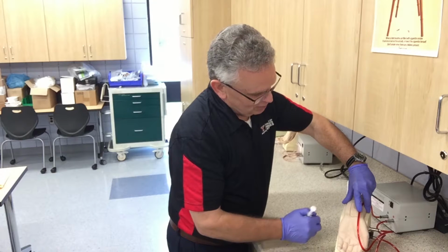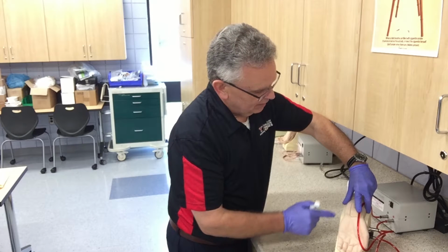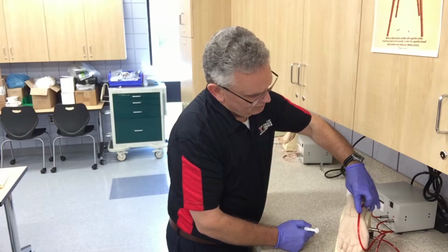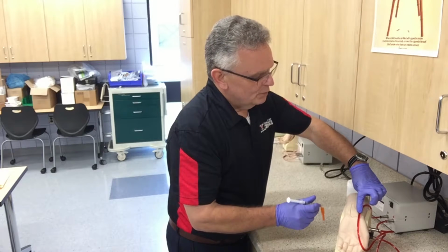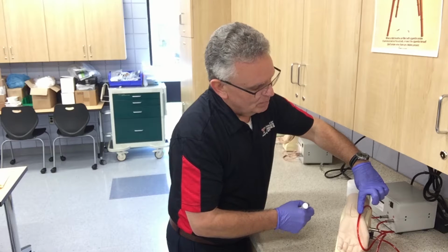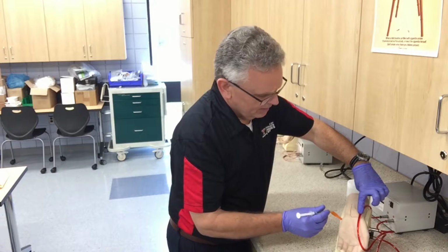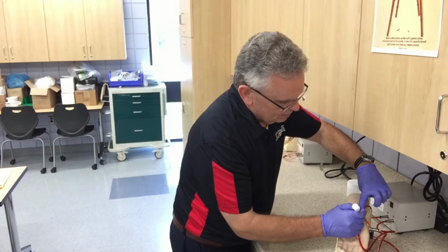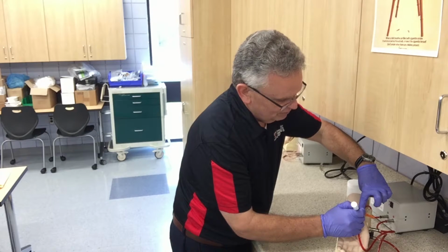So when you're palpating the radial artery, you're going to roll your finger slightly from side to side. Again, the finger is single finger technique aligned with the radial artery. You roll your finger from side to side so that you can feel the curvature of that artery. And wherever you feel the pulse to be the strongest, align the center of your fingernail with that pulse point. So this should be the center of the artery. And then you're going to take your needle and aim it towards the middle of your finger there, the center of your fingernail, and make the puncture just before your finger.